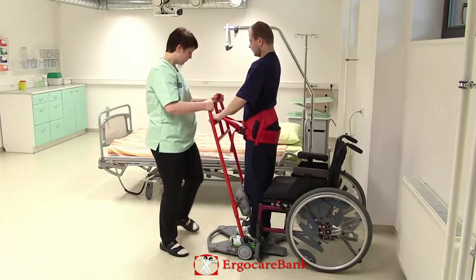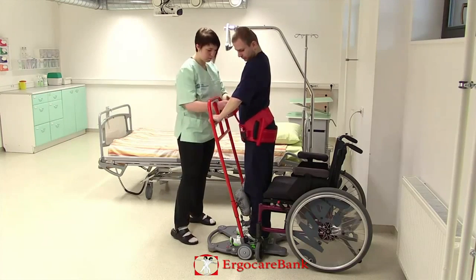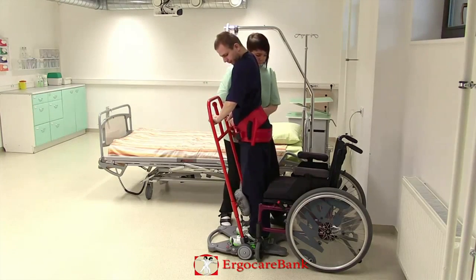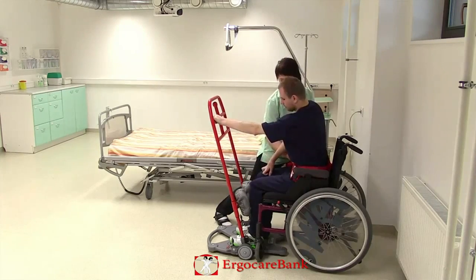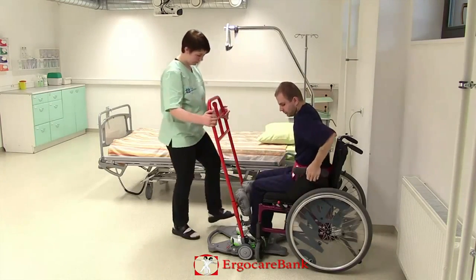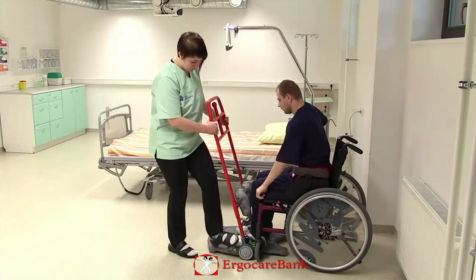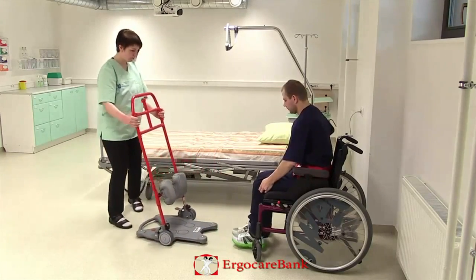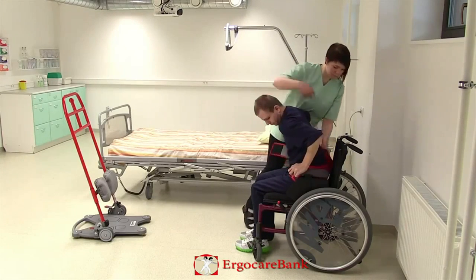She puts on the brakes and loosens the strap, and standing close to his weaker side, assists him to sit down in the wheelchair. Charlie leans forward and she removes the belt.